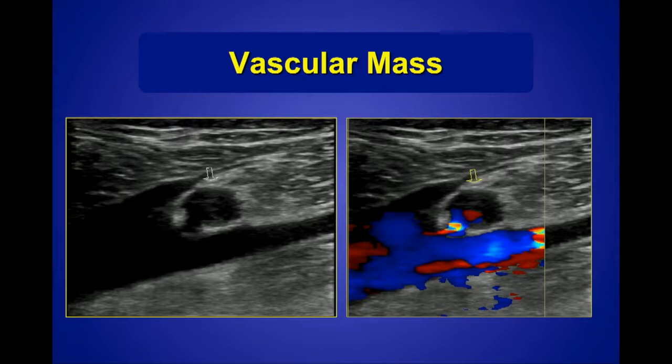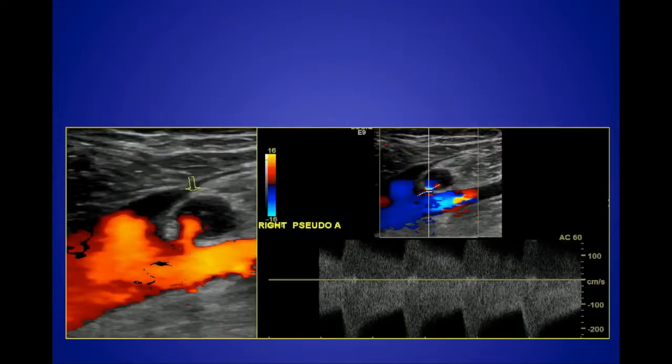And my sonographers, they love B-flow, they love power Doppler. It's great, gives us great images. And, of course, they have to sample the neck. And here's the sample that was obtained in the neck. And there's the waveform, and you can see how it's labeled. Clearly, they thought it was a pseudoaneurysm, and may have thought that this was to-and-fro flow.